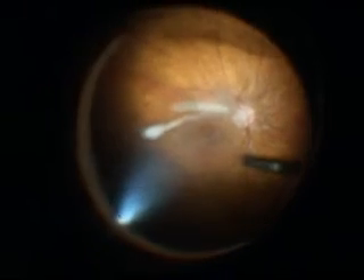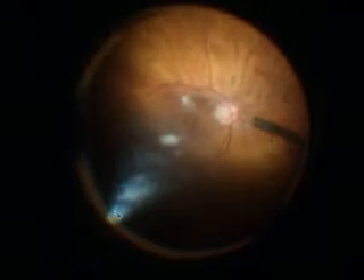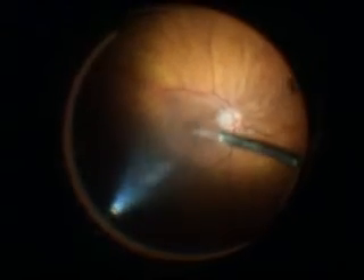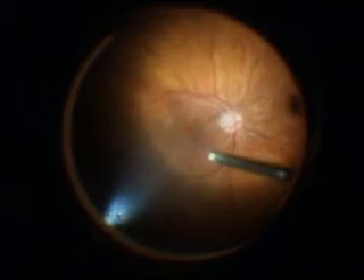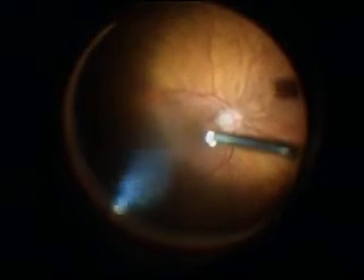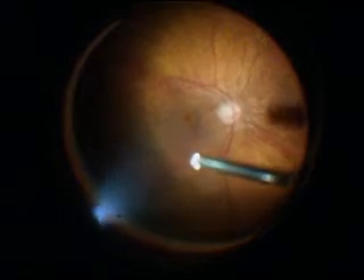Here the vitreous is actually lifted away from the macular surface.